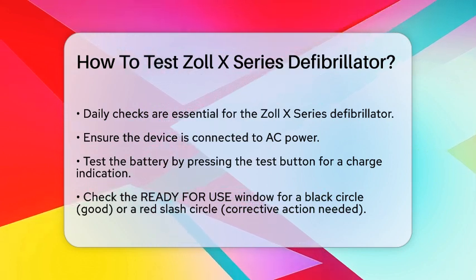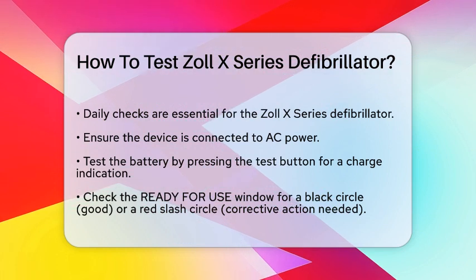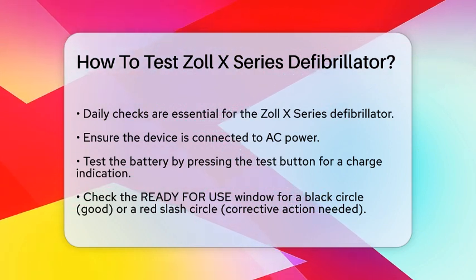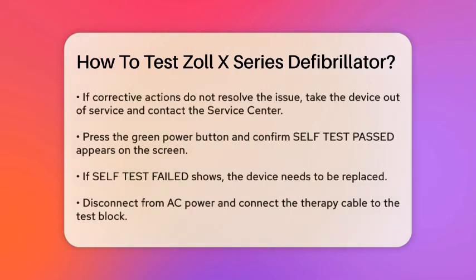Next, look at the ready-for-use window. If you see a black circle, you're good to go. If you see a red slash circle, take the corrective action displayed on the screen, such as replacing expired pads or connecting to AC power. If the black circle doesn't appear after taking corrective action, take the device out of service and call the service center.